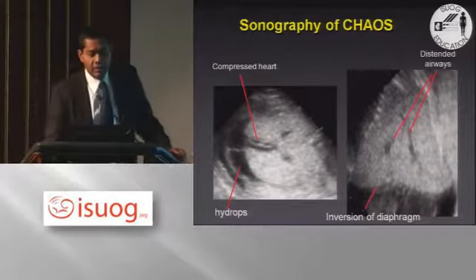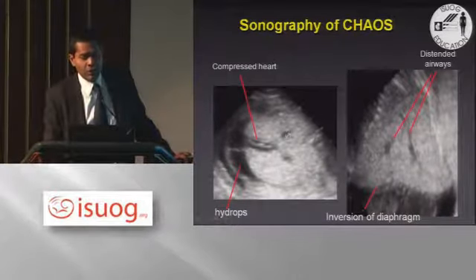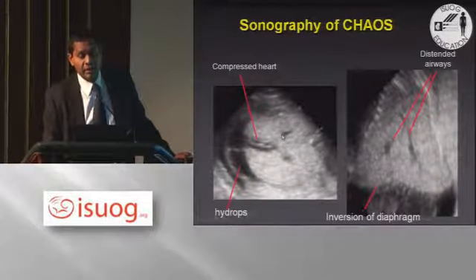These are the airways again, fluid-filled airways that are seen distinctly within the highly echogenic lungs.